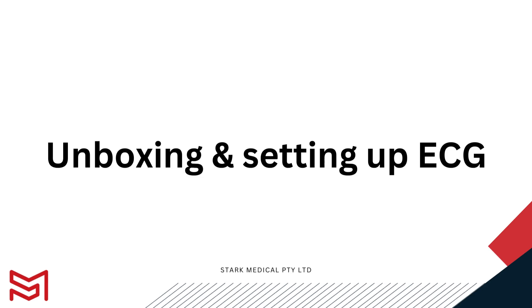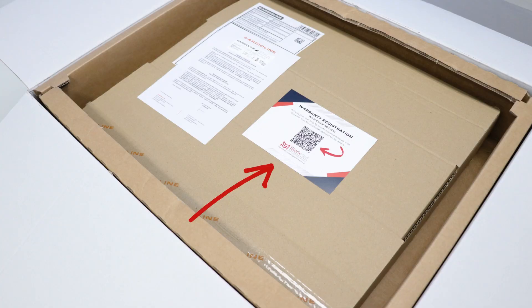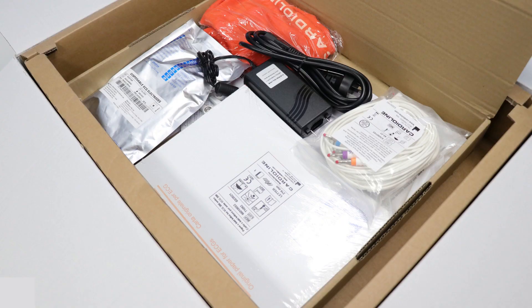Let's go through the unboxing and setting up of your ECG. In front of you, you should have your CardioLine ECG box. As you open the box, you'll see a warranty registration card straight away — scan the QR code and register your unit with us. Once you've completed the registration, open the box underneath the registration card.